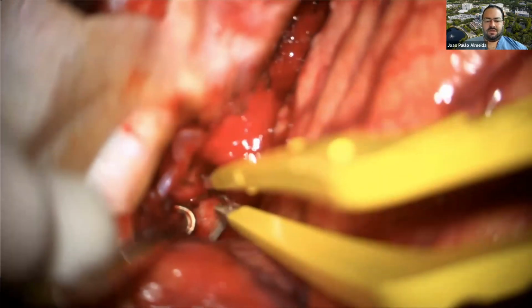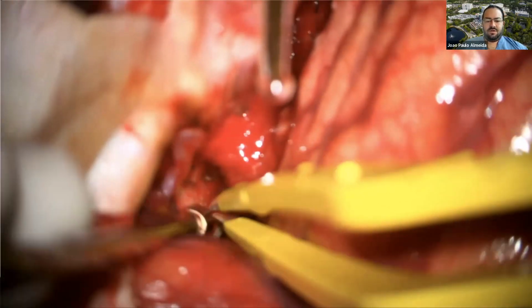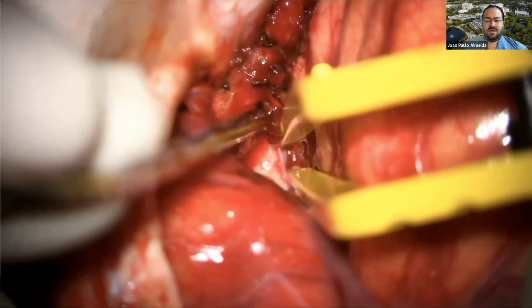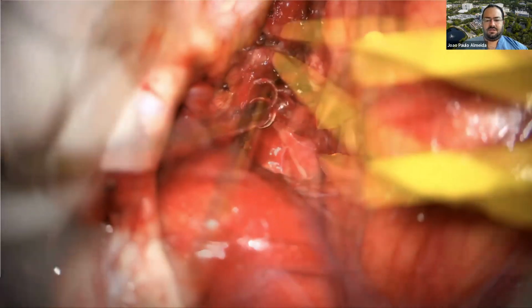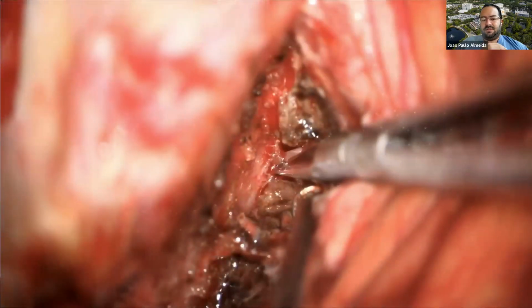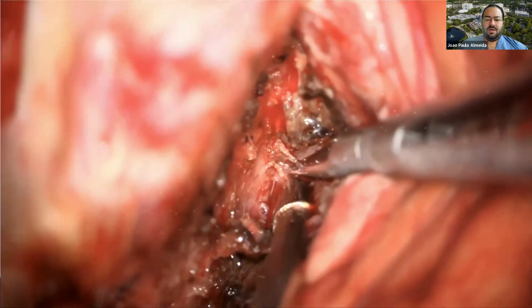You need to get, so you see the carotid. We're going to work around just to get the view, and you're going to start to see in the tentorial edge the entrance of the third nerve that you can see right there. And then after we get the lateral perspective, so that's the lateral edge of the tumor on the left side, we can go back to the plano.